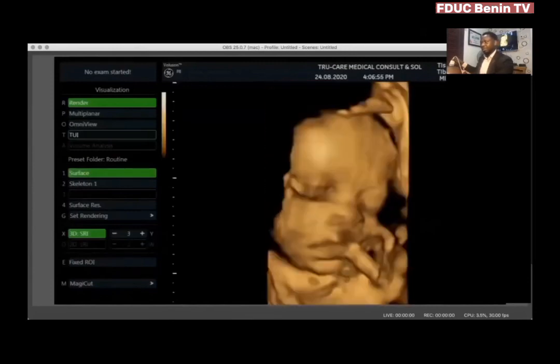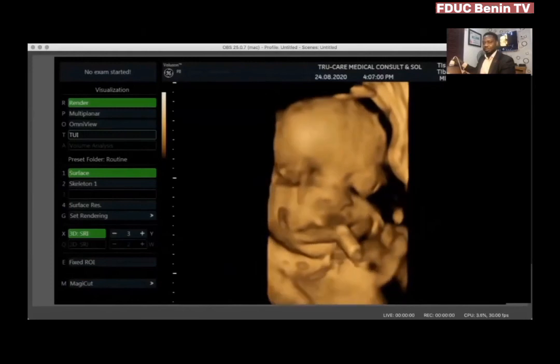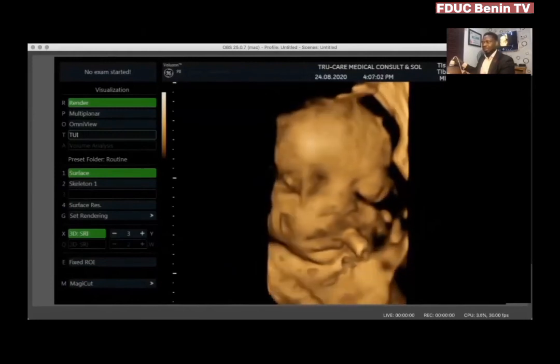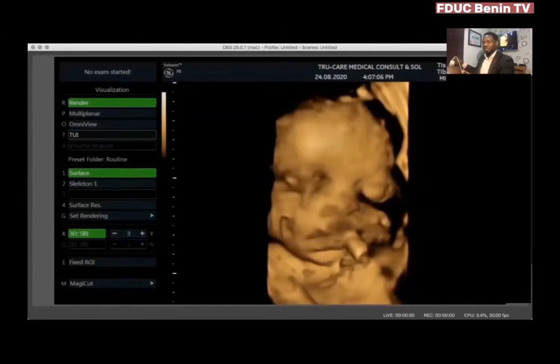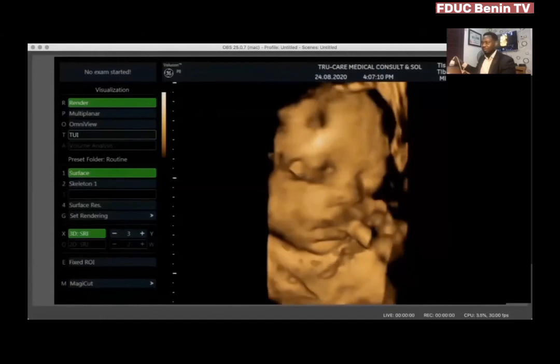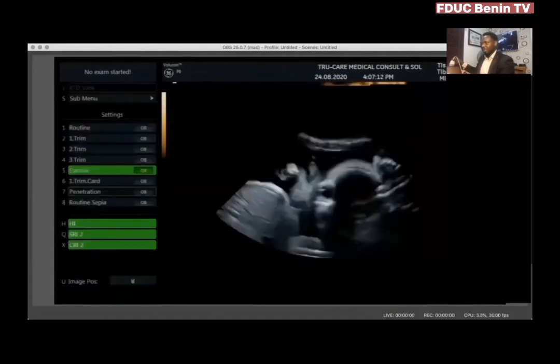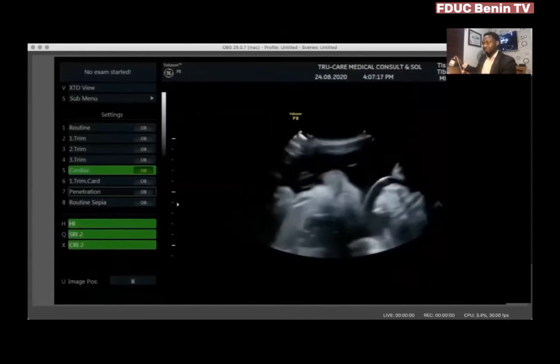So now look at this. What are we able to get? Can you see that we can see part of the baby's face? And somebody had asked, what do you do when you see some of these artifacts? You can actually take them out. So again, I'm going to go out and then let's ask ourselves, how can we make our image better?